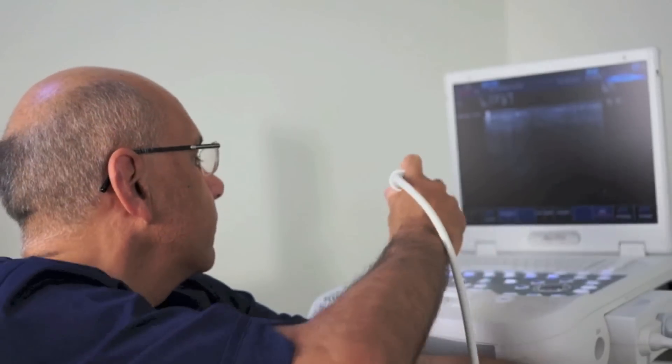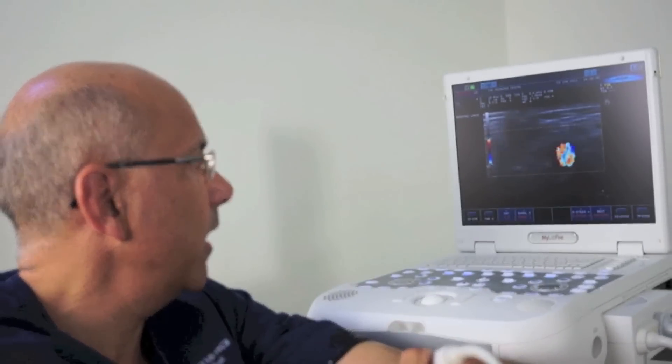One of the features characteristic of an artery is that when you press gently with the probe it doesn't compress — it's not squidgy. We can see the structures quite well with the B-mode, the grayscale ultrasound. Now if I turn on the colour flow detector and look at that area, we can demonstrate blood flow within that blood vessel. This is colour duplex ultrasound — we can see the structures but we can also see the direction of flow and the movement of blood within blood vessels.